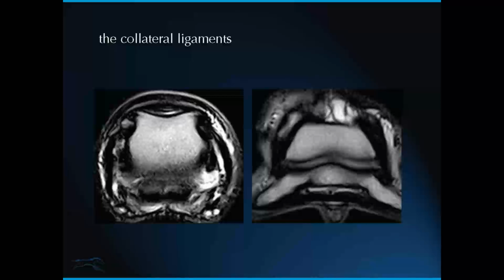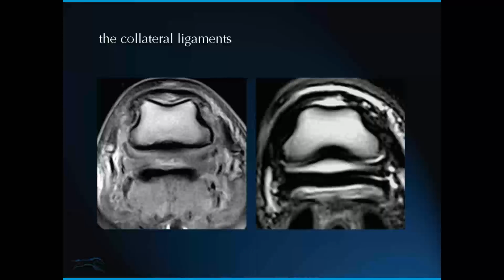And this was his injury. I've used this image already, but you can see this area of hyperintensity in the transverse and the dorsal plane here. You can see all that periligamentous tissue that's formed around there. They tend to be a bit like suspensory branches in that they kick out lots of tissue. They're not all that obvious, unfortunately.